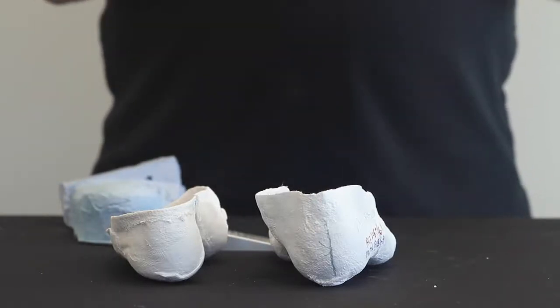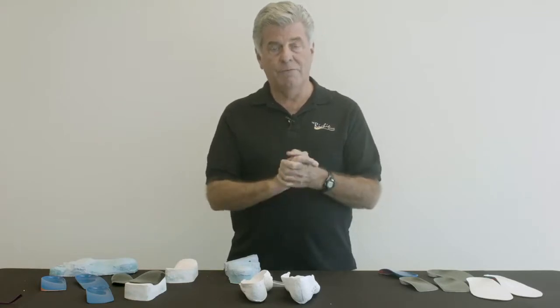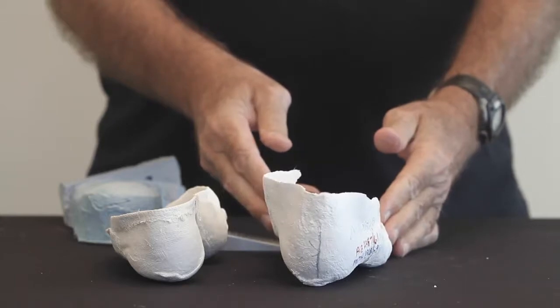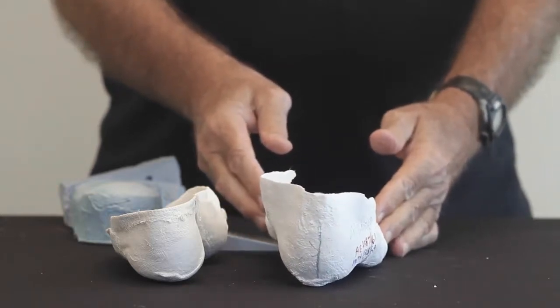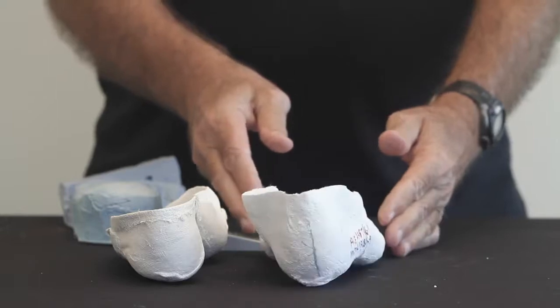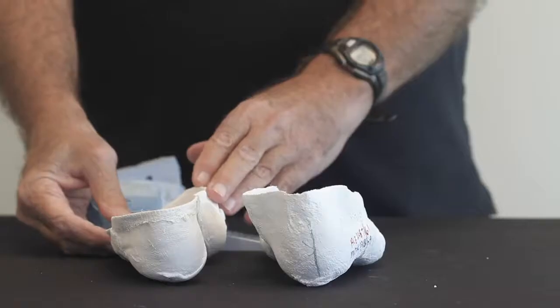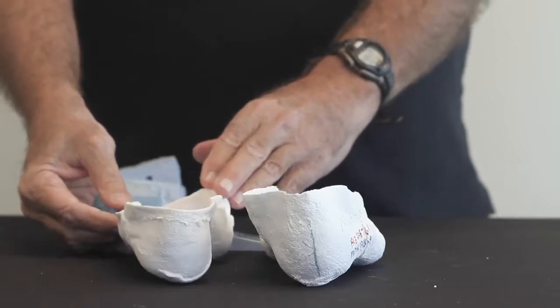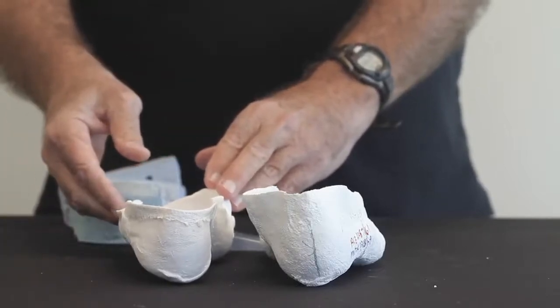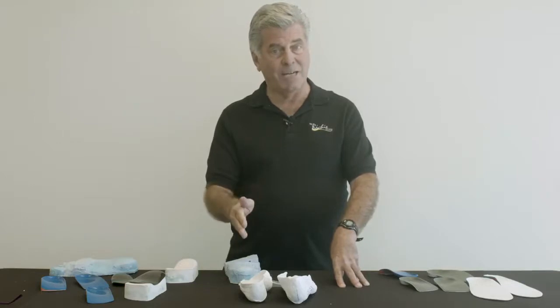Here are two negative impression casts taken of two different patients, which captures two different forefoot to rear foot deformities. This cast captures a forefoot varus deformity, where with the heel in a neutral position, the forefoot is inverted to the supportive surface, and when I let go, the cast drops into eversion. This is a cast taken of a patient who has a forefoot valgus deformity, so that when their heel is perpendicular, the forefoot is everted to the rear foot, and when we let the cast drop to the surface, the heel appears inverted to that exact amount of deformity.